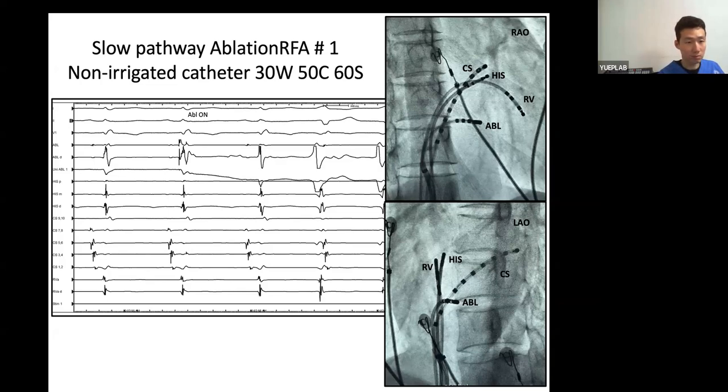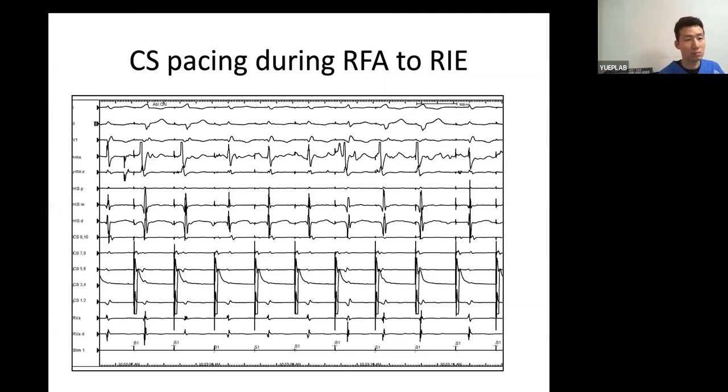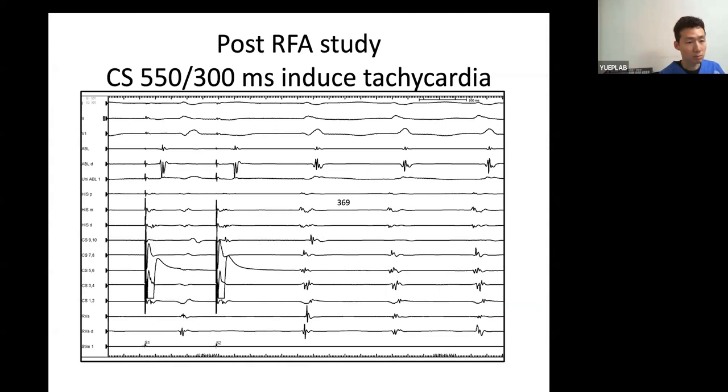Okay, next. And then you did the venogram. Okay, you see during the ablation you got a lot of PVCs, so that means the catheter is still hitting the ventricle. Okay, keep going. So then you still induce tachycardia, same. Okay, now the His bundle catheter moved again. Your EGM changes a little bit. Okay, now His is probably slightly later than before, but still you have that sharp potential in 5, 6, 7, 8, right? And CS, you see that first beat. Okay, keep going.